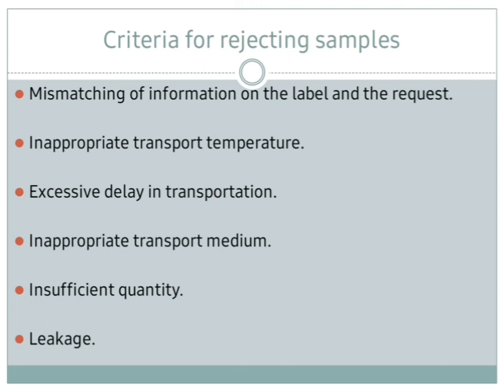Also excessive delay in transportation, because we mentioned that it must be rapid, and inappropriate transport medium, insufficient quantity, and leakage of the sample. These are the reasons, these points make us reject the sample we receive.